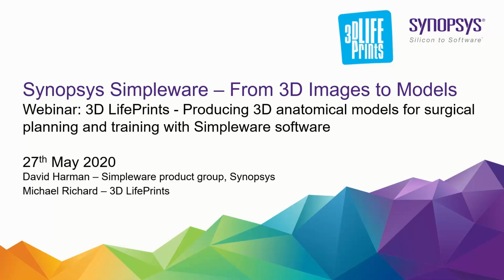Today, I'm going to give you a short introduction to the Simpleware product group at Synopsys and what we do with our software and what it can offer you. And then I'm really going to hand over to 3D LifePrints. So Michael Richard, head of engineering at 3D LifePrints, is here with us today. He's going to take you through who 3D LifePrints are and how they utilize the Simpleware software within their processes.